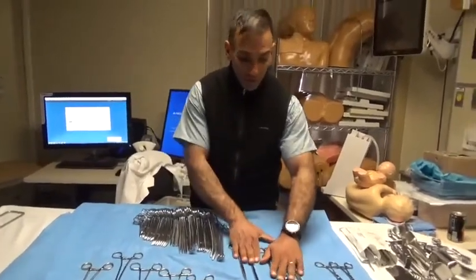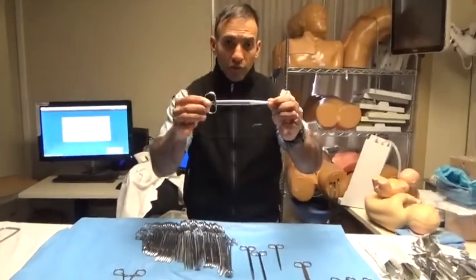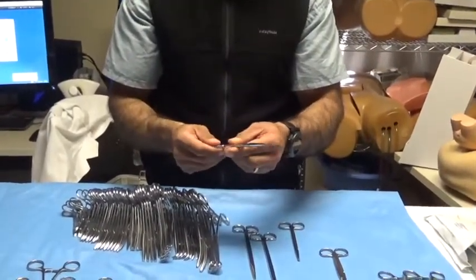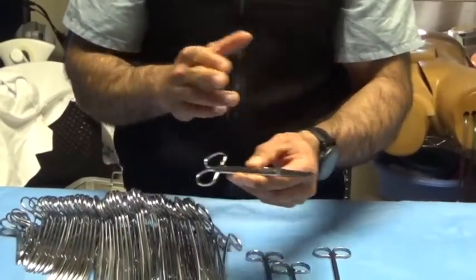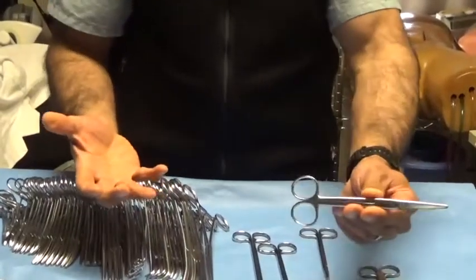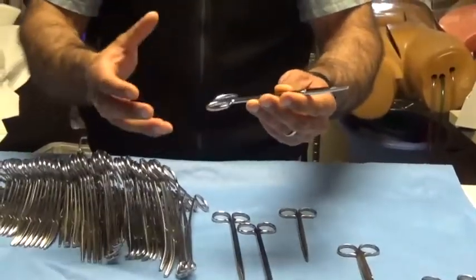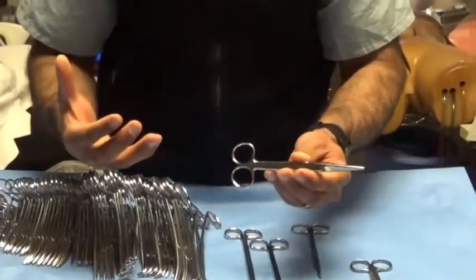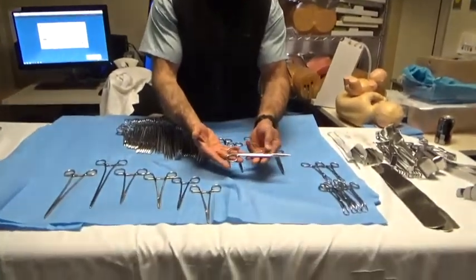Moving on to scissors — from a medical student perspective, the next most important instrument after retractors is suture scissors. Suture scissors, also called mayo scissors or straight mayo scissors, tend to be heavier scissors. They're not designed to cut tissue; they're designed to cut suture and dressing materials. How you hold your instruments conveys your knowledge of how the tools work, so proper grip is important.